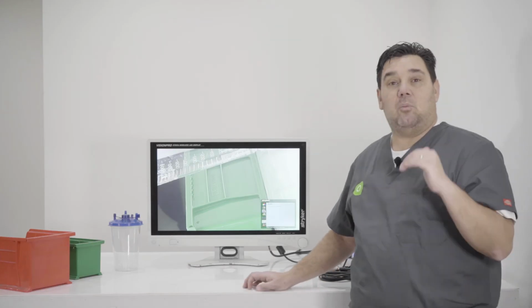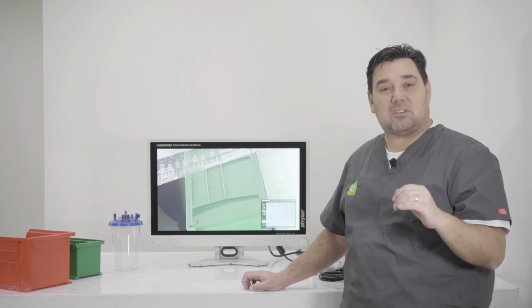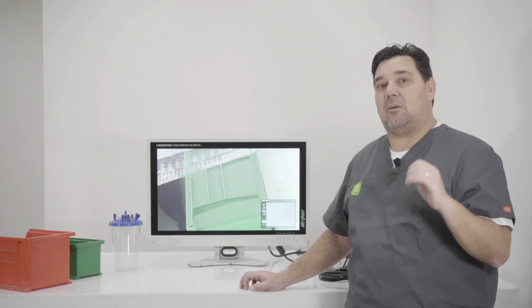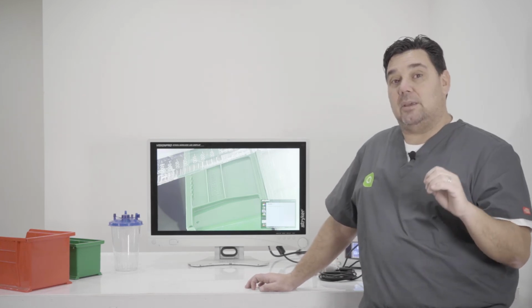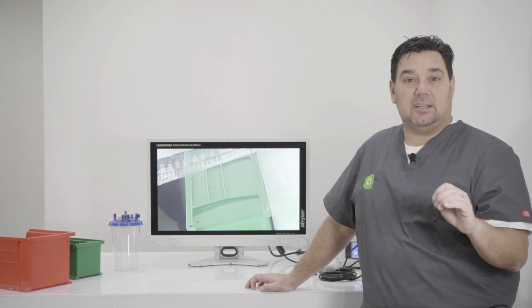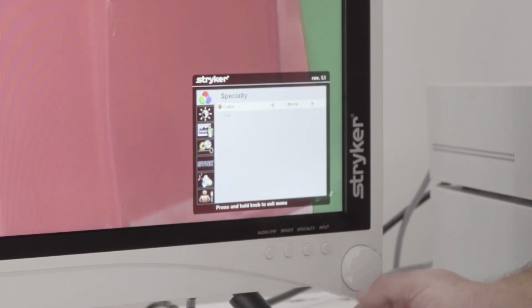So now, what we want to do is get into a specific specialty setting in the monitor. Again, this is what I talked about when we first started this video, where we could set a setting for a specific surgeon.